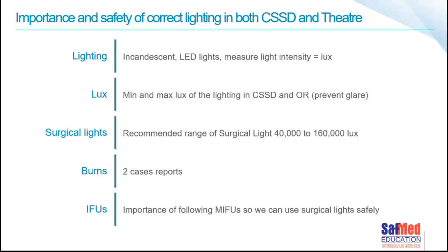We know of 2 case reports now that were reported in recent times of burns from surgical lights. And please, even though those lights feel a lot less hot than the older incandescent lights or the halogens that we used to work under, they still can cause injury and we can still burn our patients. And then follow the manufacturer's instructions for use. So making sure that on installation you get all the right training, that you know correctly how to use the lights, but remember at the end of the day, do not overlap them.